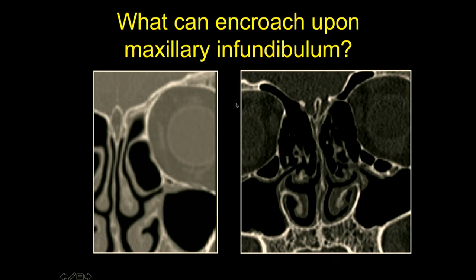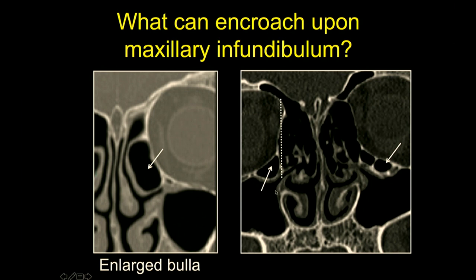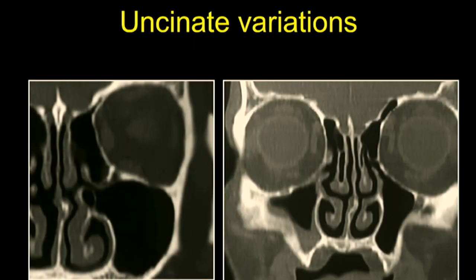What can encroach on the maxillary infundibulum and result in obstructive sinusitis? A large bulla can obstruct the infundibulum. Haller cells — anteroethmoidal cells that go into the floor of the orbit, lying lateral to the lamina papyracea — when large, can also obstruct the infundibulum. Various uncinate variations can encroach onto the infundibulum, such as a hooked uncinate or a pneumatized uncinate. An atelectatic uncinate reaching very close to the medial wall of the orbit can result in obstructive sinusitis and make the orbit very prone to injury during endoscopic procedures.